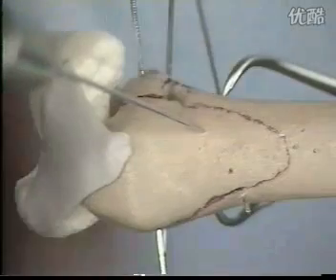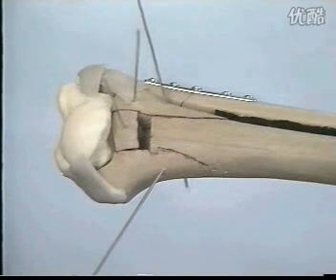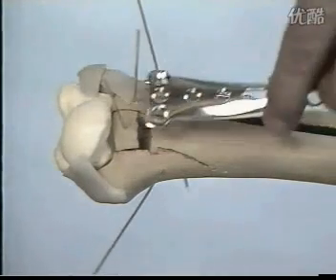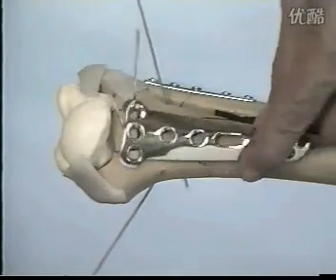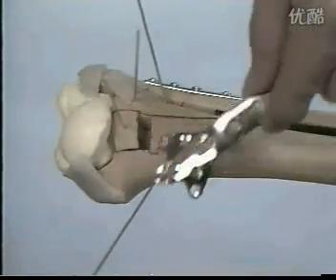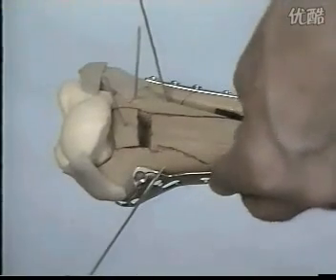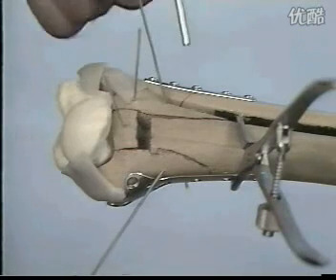This view shows the tibial joint section reconstructed on the talus and the central defect above it. We now plan final stabilization with the help of a buttress plate and screws. Instead of a massive frontal spoon plate, we prefer to use a cloverleaf plate, which matches the medial contour. This will prevent a varus deviation. Step by step, we replace the Kirschner wires by screws.